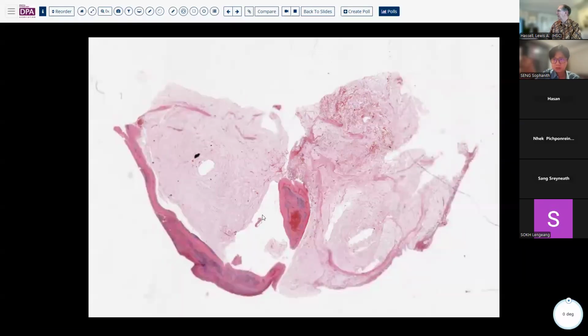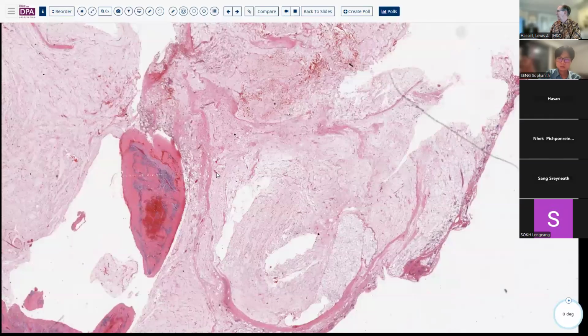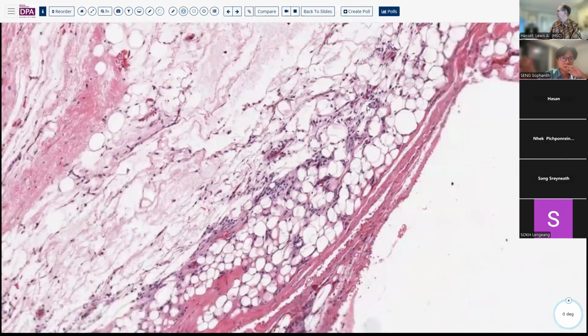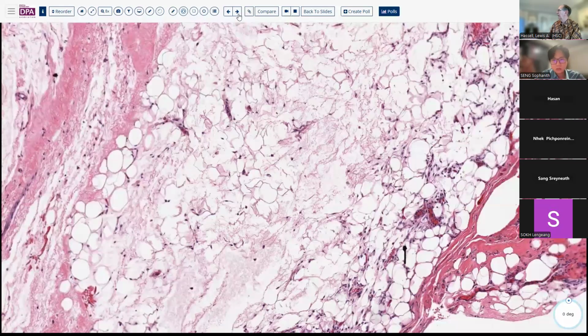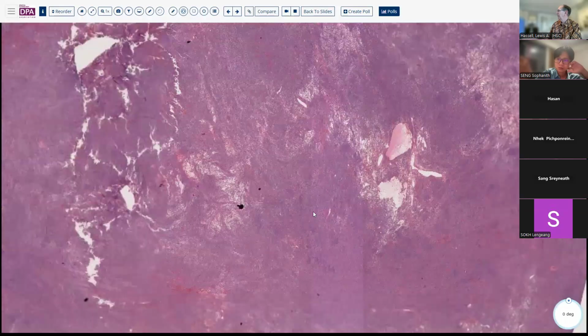And then some other lesions that can occur in this area, liposarcomas, usually not the well-differentiated type, but more typically the round cell type of myxoid liposarcoma that may have a predominance of lipoblasts. I think you can find a few here if you come back later and take a look at this lesion. I think you'll find some cells like this that have reasonably good lipoblastic character. This is a lesion to consider as well. Very uncommon. Another uncommon neoplasm in this location would be synovial sarcoma, but certainly not beyond consideration.